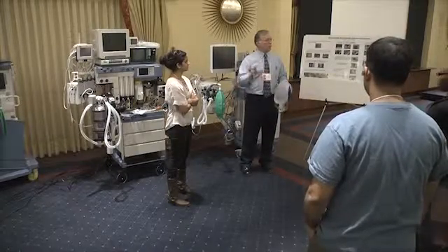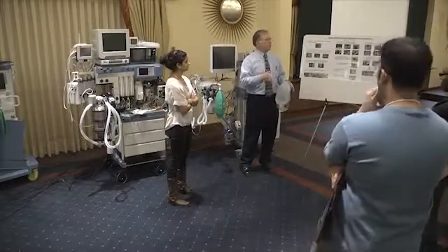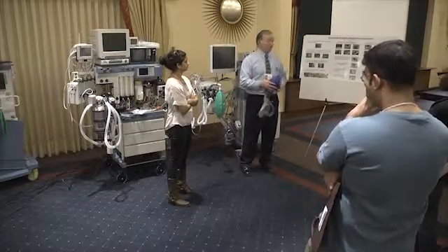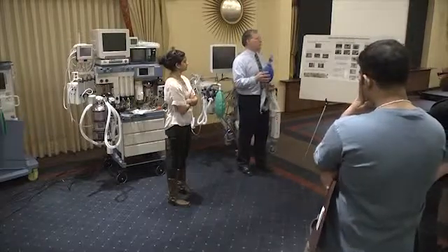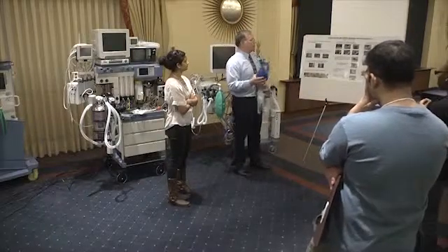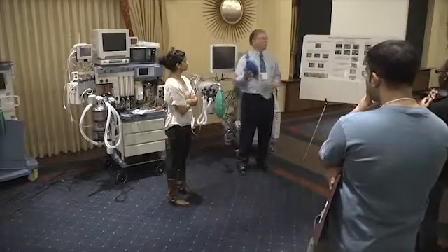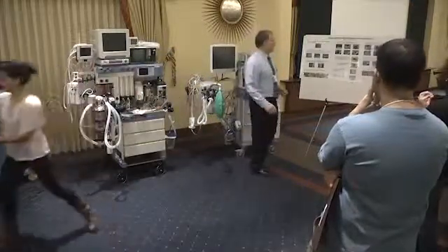And remember, when you administer gas, it always goes to the area of least resistance. So depending upon the hole and the toughness of your patient's lungs, you might not be able to ventilate. And I mean, that was a real key point. You're really caught when you really need this. This is way more important than if you had your oxygen cylinder empty out. So I can't emphasize enough to touch and become one with your ambu bag. Become one with the ambu bag.